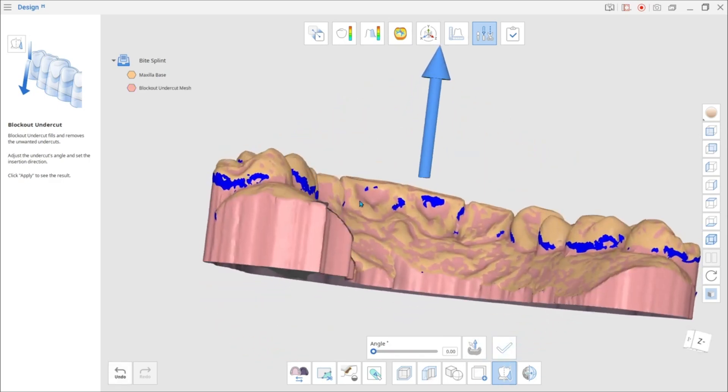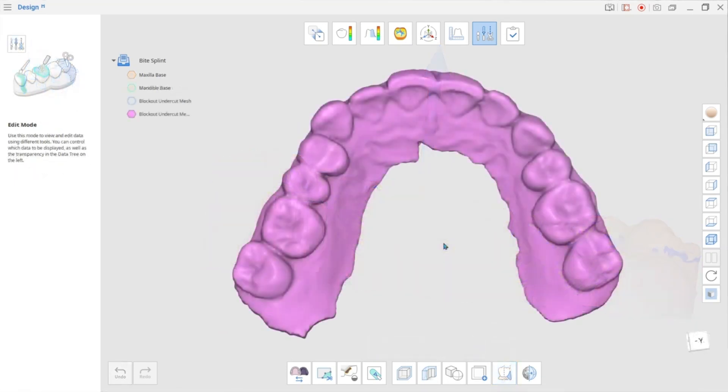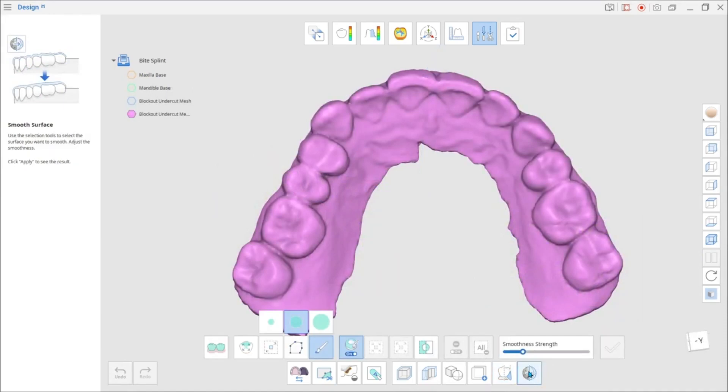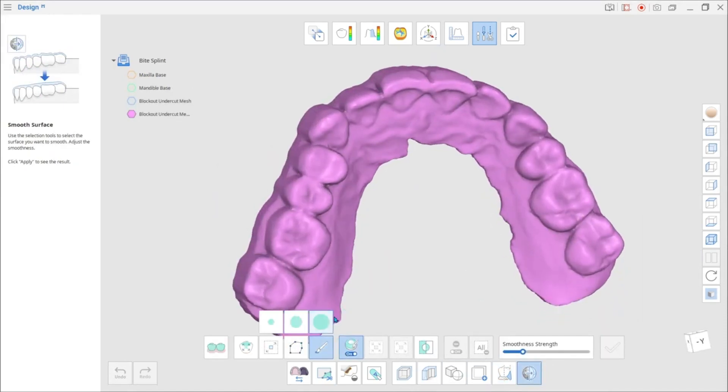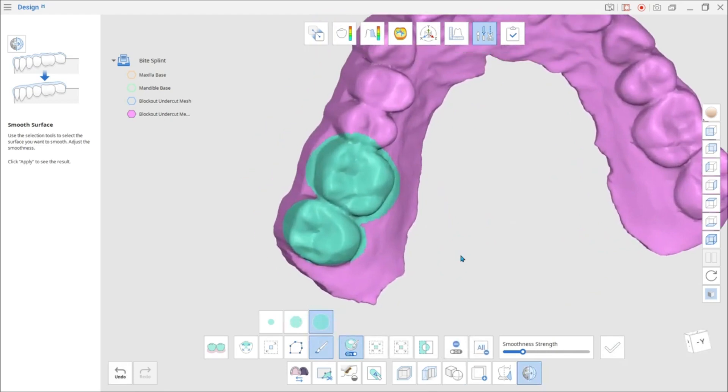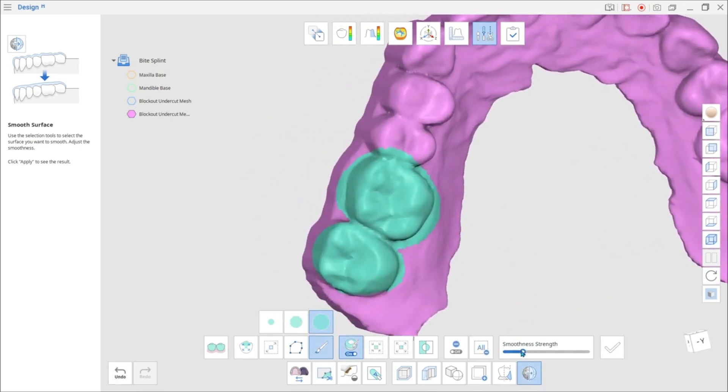Surface Smoothness can be adjusted with the Smooth Surface tool from the bottom toolbar. Select the surface area. Adjust the Smoothness strength using the slider and click Apply.